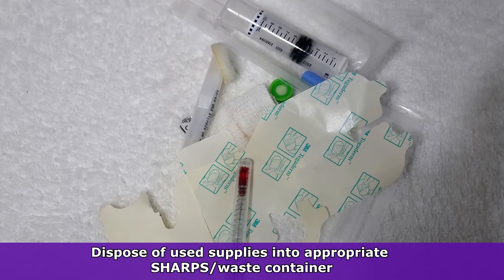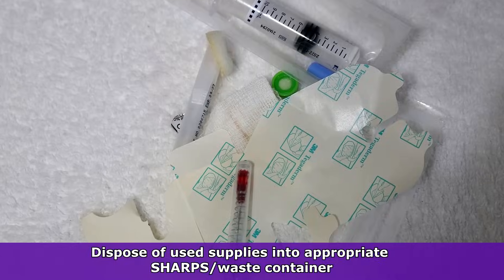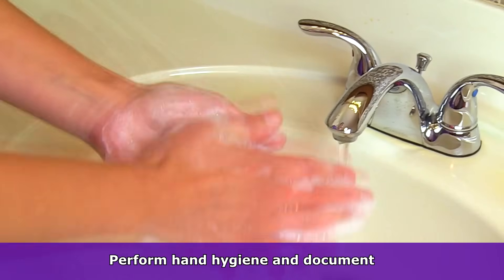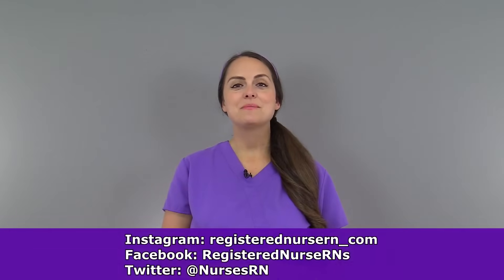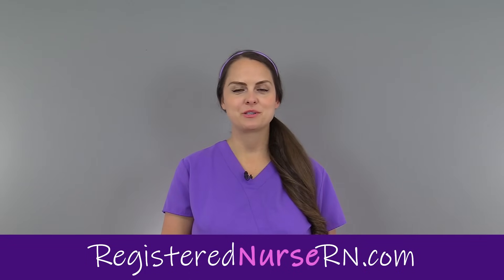Then dispose of this in the receptacle area that your facility requires for these types of items. Remove your gloves, perform hand hygiene, and document. That wraps up this video, and if you would like to watch more videos on nursing skills, you can access the link in the YouTube description below.